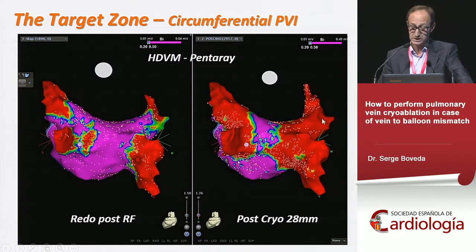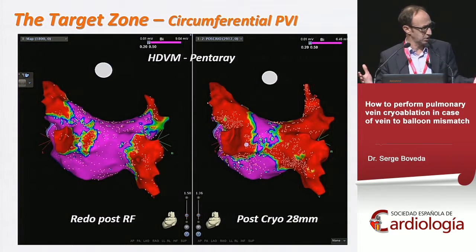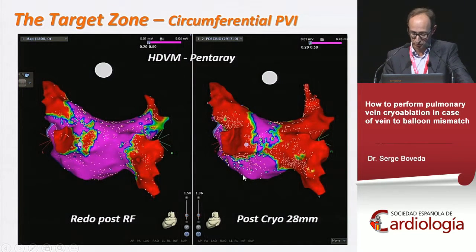And here you can see that, especially for the right veins, the lesion is wide, it's big, and it's nearly joining here at the bottom of the posterior wall. In fact, my first impression was to say, wow, where is the esophagus? Because we are occluding maybe quite all the posterior wall.